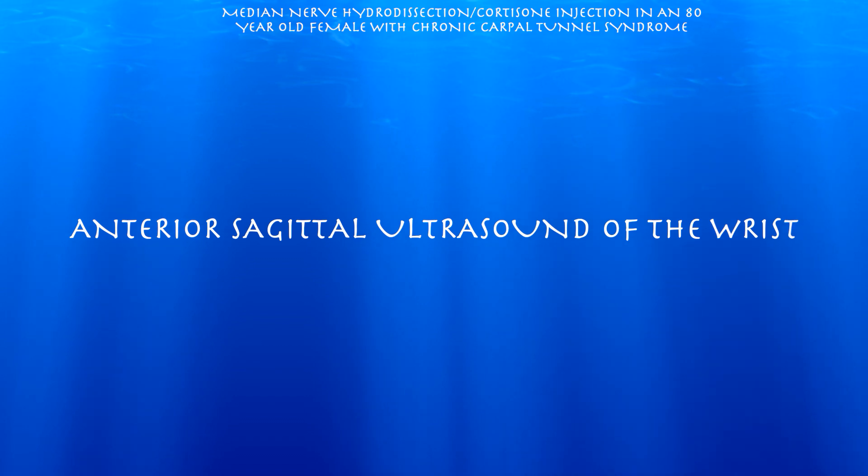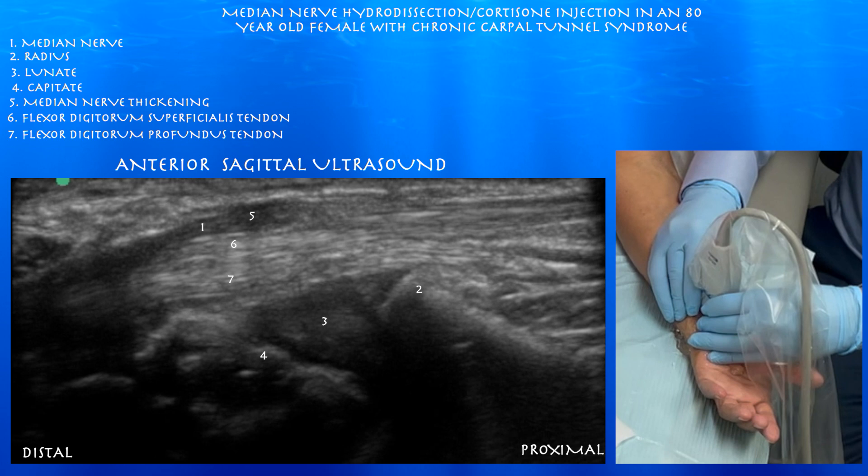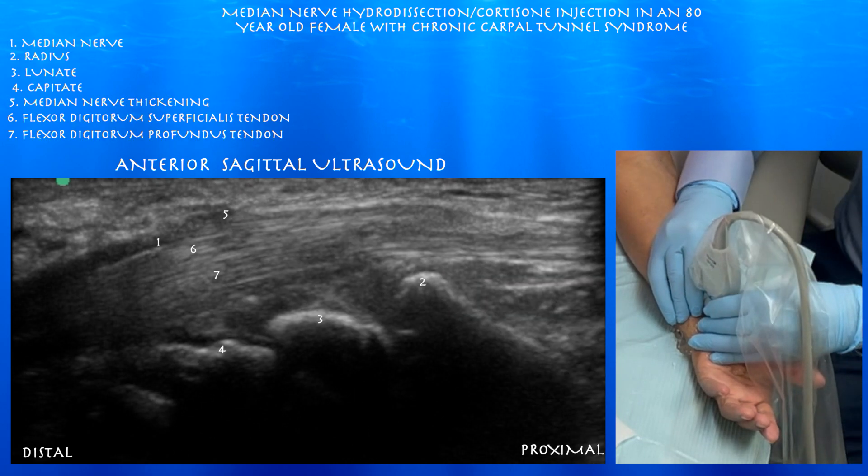Now we're going to look at the median nerve in a long axis view, or a sagittal plane, over the volar wrist. You can appreciate there is some thickening of the median nerve as it's entering the carpal tunnel, and there appears to be somewhat of a notch sign as well. You can appreciate the underlying bony structures as well.